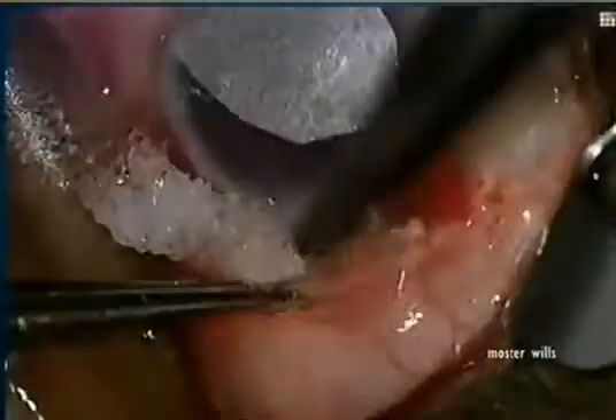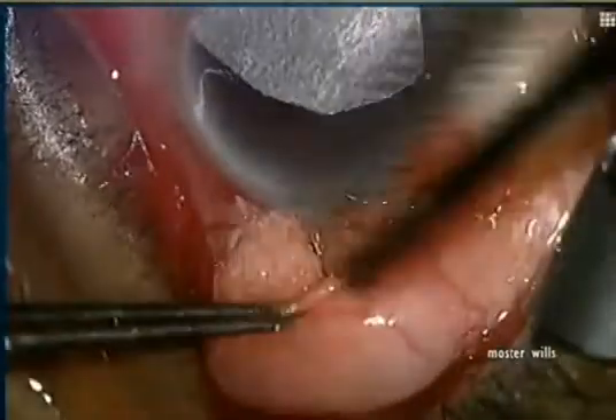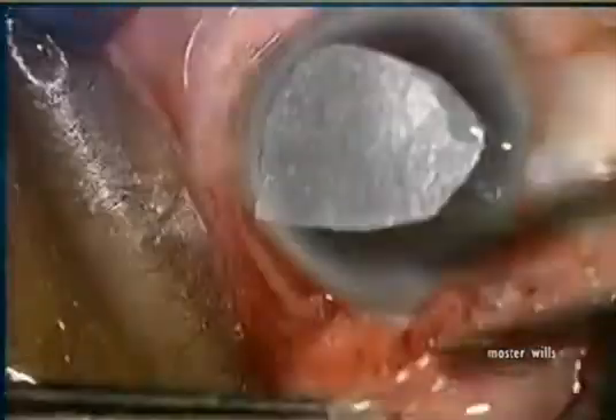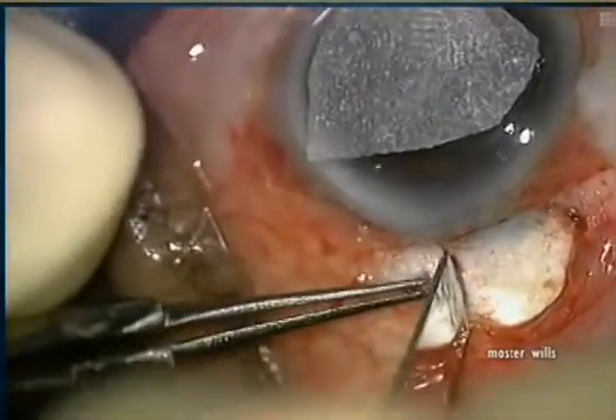We're working temporally here, avoiding the old trabeculectomy. Mitomycin C sponges are placed over a large surface area at 0.4 milligrams per cc and left on the eye for one and a half minutes, then irrigated out.